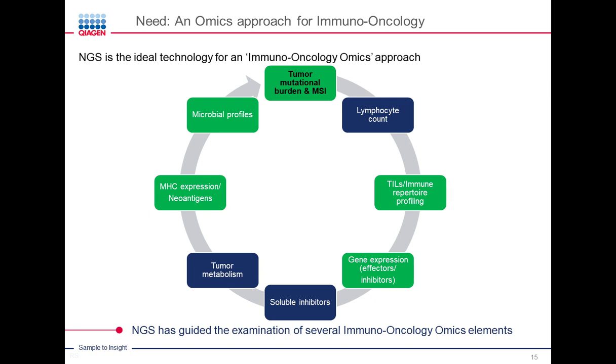And one of the elements that I will focus on today is, of course, the TMB mainly. MSI won't be part of this presentation, but the focus is going to be on TMB and how you could use a large panel that has been developed to be pan-cancer, pan-biomarker, to also assess tumor mutational burden status.